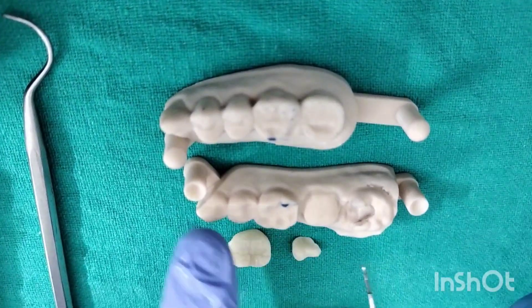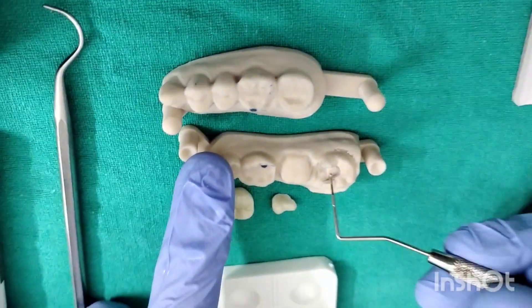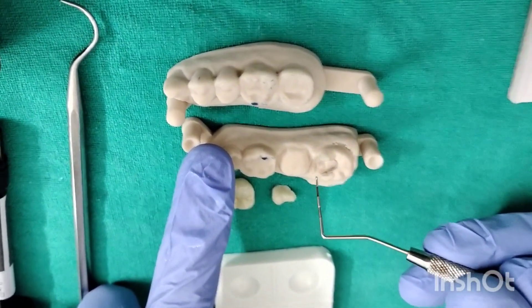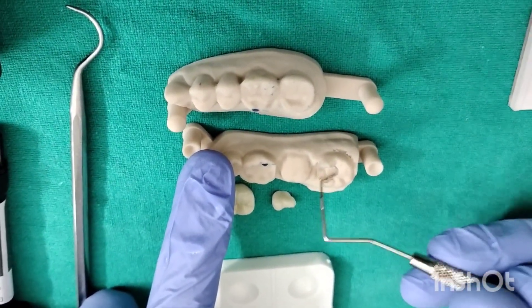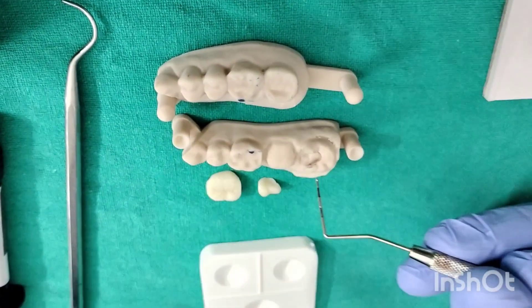When you are drying, you have to make sure you do not desiccate the surface of the tooth because that will affect the bonding of the bonding agent.